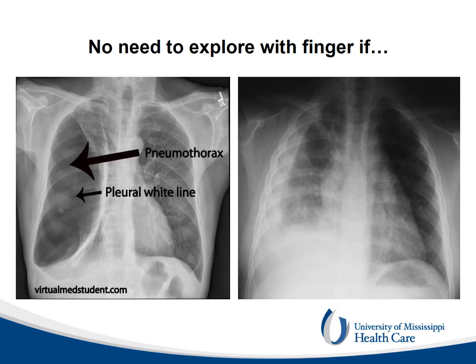However, there is no need to explore the chest cavity with a finger if a previous chest X-ray has already shown a large amount of air or fluid between the lung and the chest wall. Insertion of a finger in these cases only increases the risk of carrying skin bacteria inside the chest.